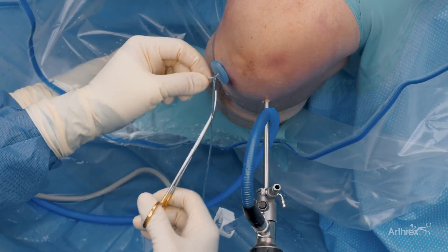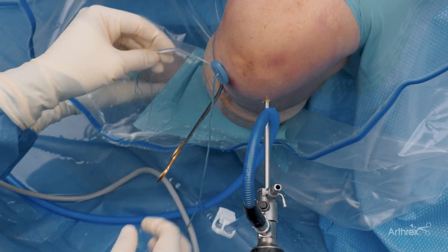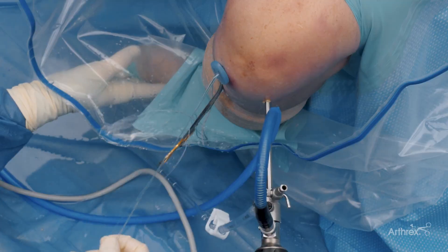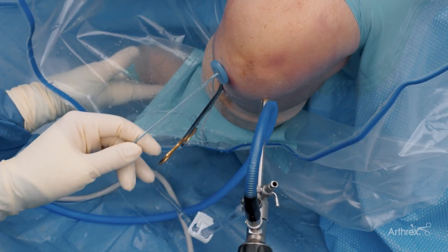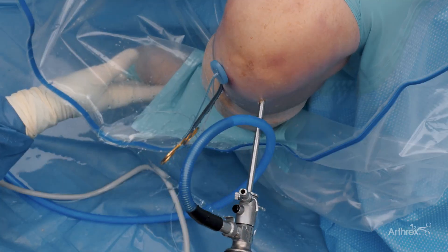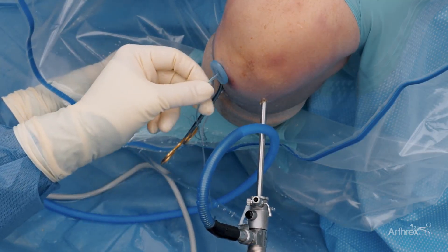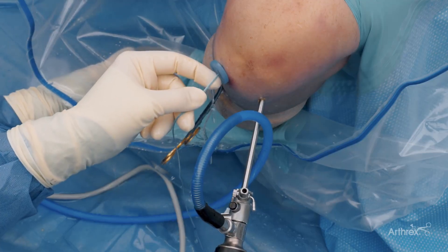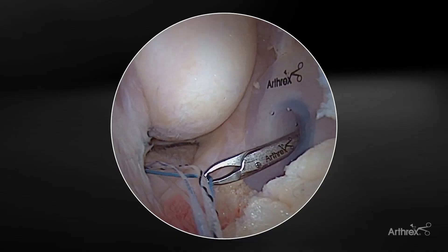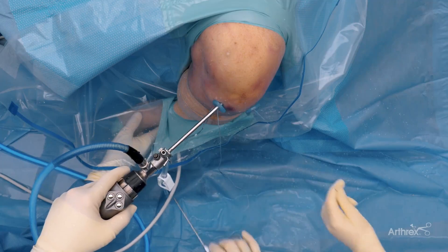A hemostat is utilized so that the sutures don't accidentally deploy as you're managing the meniscus root repair. Now we have to manage the sutures, and the key is to first pass a vertical suture so that we have a Mason-Allen configuration in the back of this meniscus. This has been proven biomechanically to be superior when doing meniscus root repair. In order to do this, we're going to bring all the sutures that we're not using into the scope portal. The first blue suture is then brought through the lateral passport and will be loaded up on the scorpion to do the vertical repair.